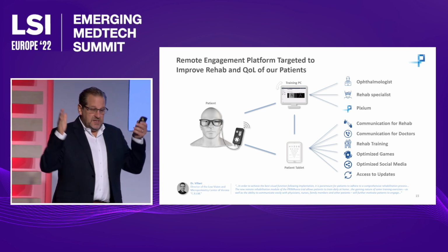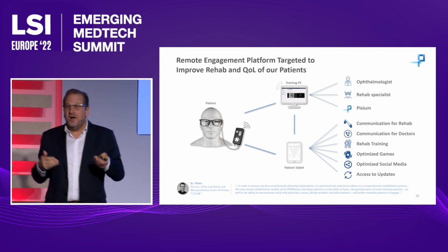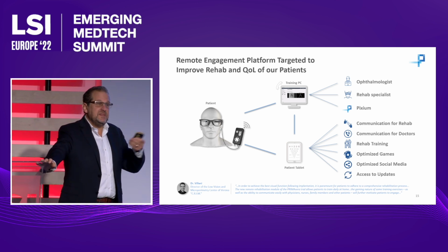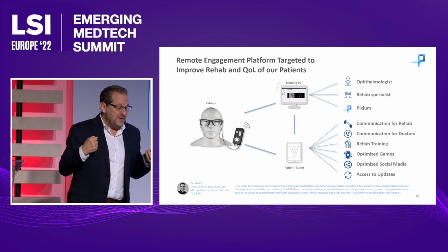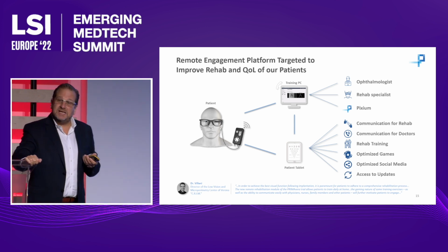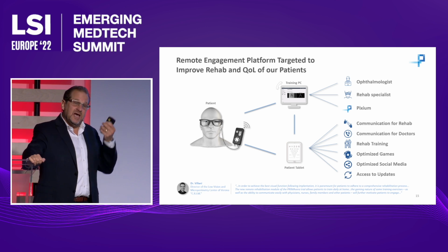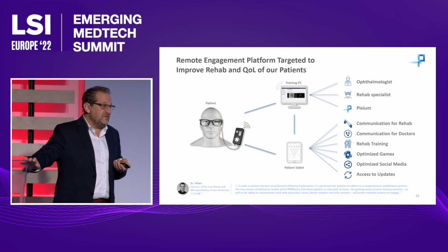So typically, after the implantation is done, patients will come to clinic for about 3 months, where they're learning to use the system, and then we send them home, and through a remote rehabilitation process, where the rehab expert is in clinic and the patient is at home, we can monitor progress. We can actually have them do exercises to begin to improve their visual acuity and use of the system, and we can collect information on how their visual acuity is improving over time from the comfort of their own home.